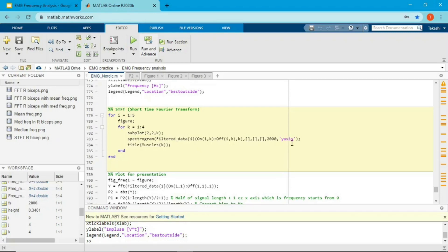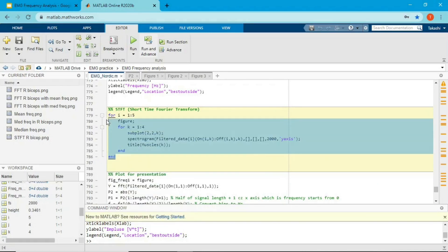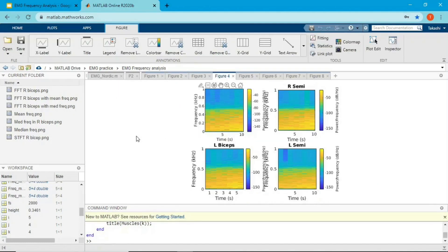You don't have to put the 'yaxis' argument — it just rotates the axis so frequency is on y-axis instead of x-axis. If you want the default orientation, just remove it and frequency moves to x-axis. Running this gives you the spectrogram — here is trial 1.